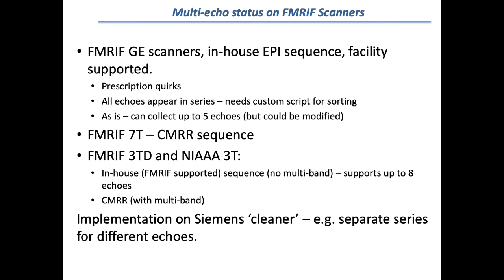Because of these quirks, you have essentially one series of images where your echoes are mixed up, and you have to use a script that we provide to separate them out and build your data sets. But we've had that going for several years now. It's a fairly well understood problem and solution. This sequence is also the only one of all our multi-echoes that has gating capability.